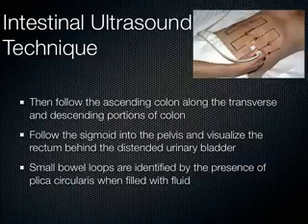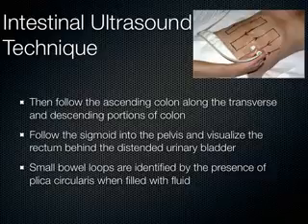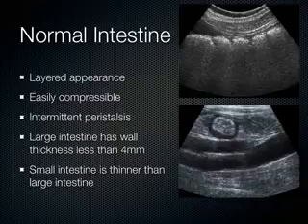And then, again, to try to differentiate small bowel from large bowel is difficult to do with air-filled loops of bowel in normal individuals. But when the patients have disease states, then you can really make out the plicae circularis. I'll show you some examples of that.